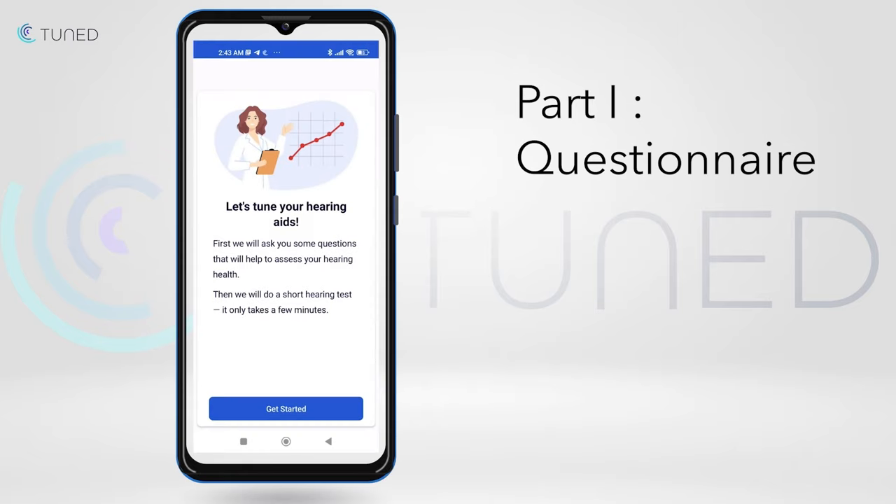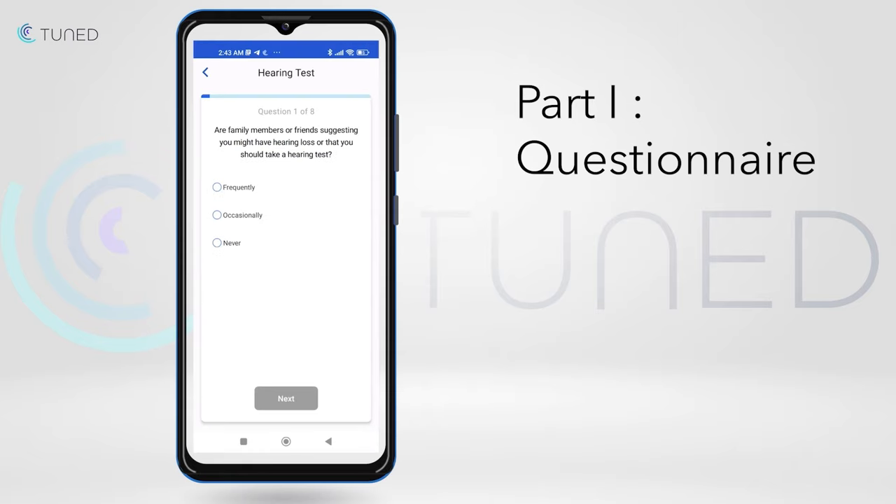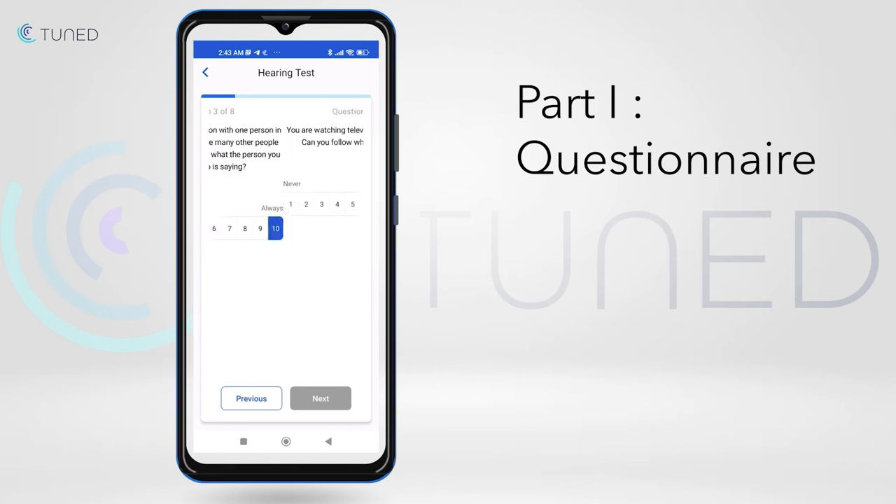First, the user needs to answer some questions. The answers will affect the hearing aid fitting. The goal of the questionnaire is to assess the user's own perception of their hearing loss. To get the most accurate results, it is important to take the hearing test in a quiet environment.